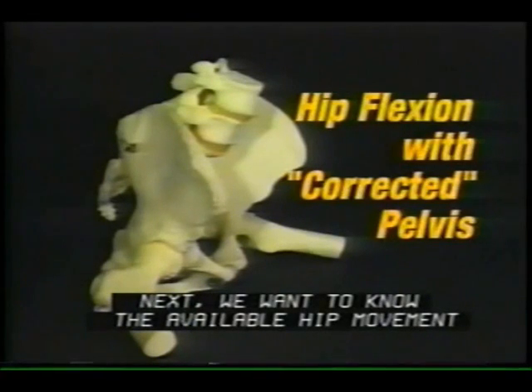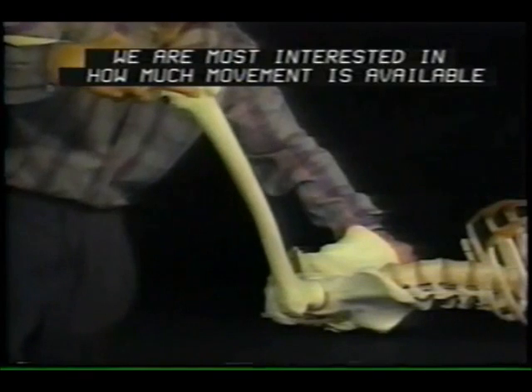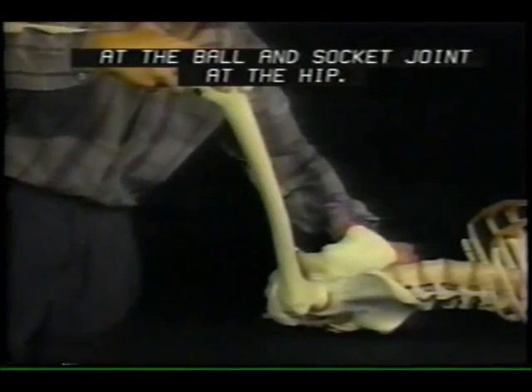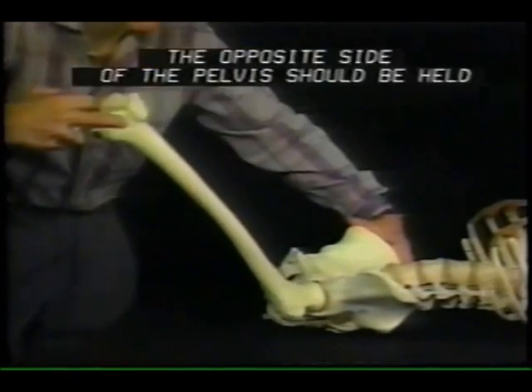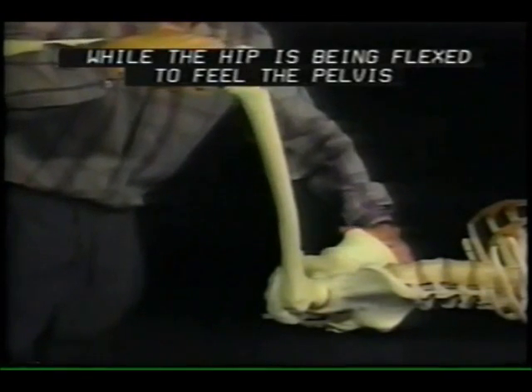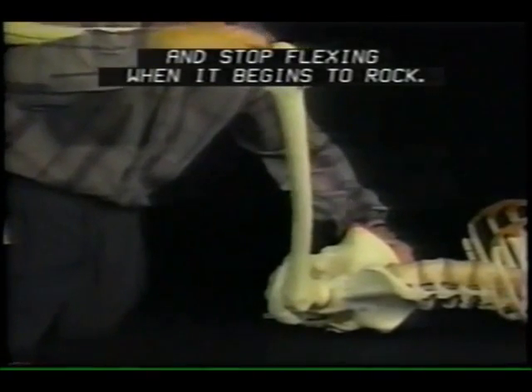Next, we want to know the available hip movement while we keep the pelvis in this corrected position. We are most interested in how much movement is available at the ball and socket joint at the hip. We do not want the pelvis to move out of the corrected position. The opposite side of the pelvis should be held while the hip is being flexed to feel the pelvis, and stop flexing when it begins to rock.